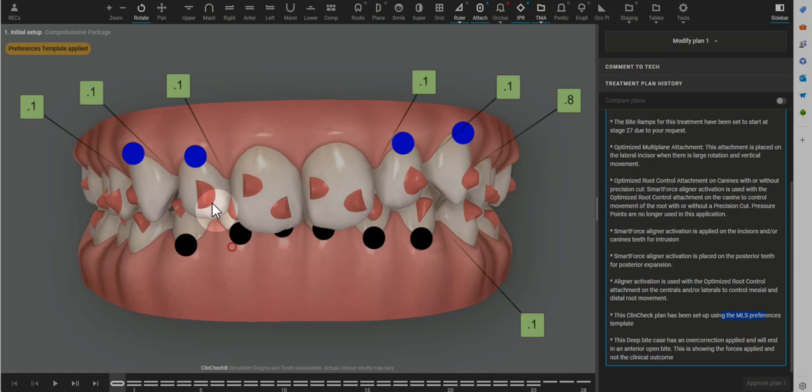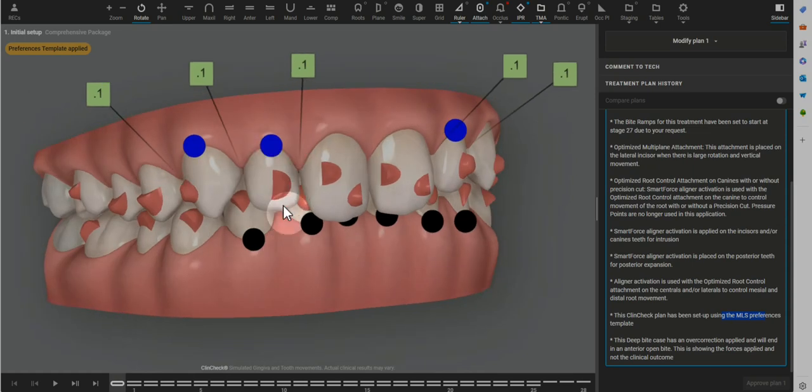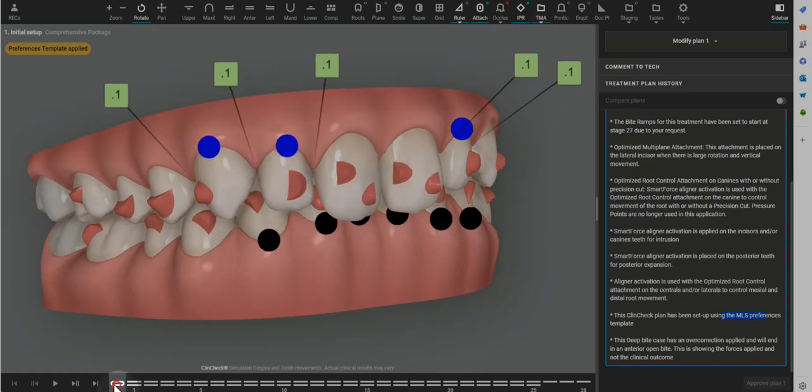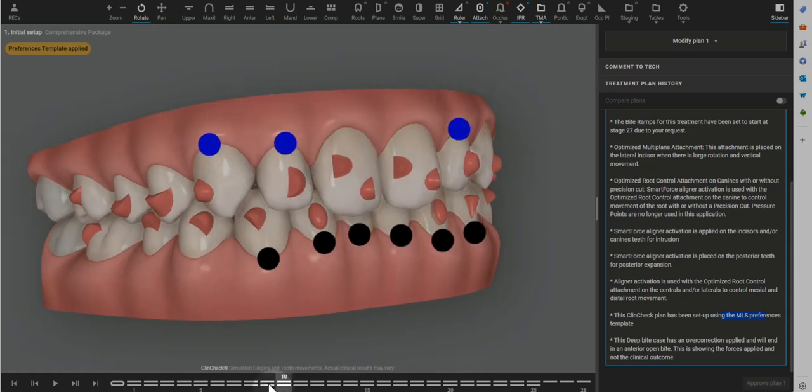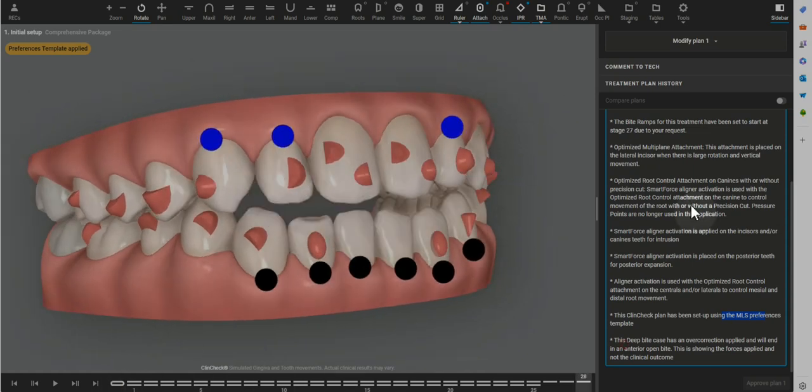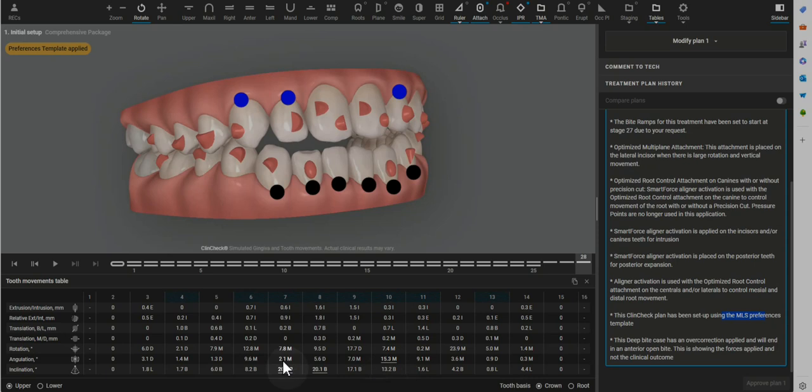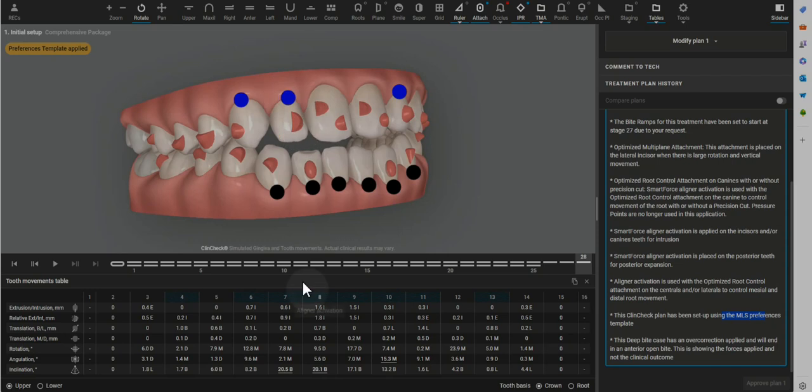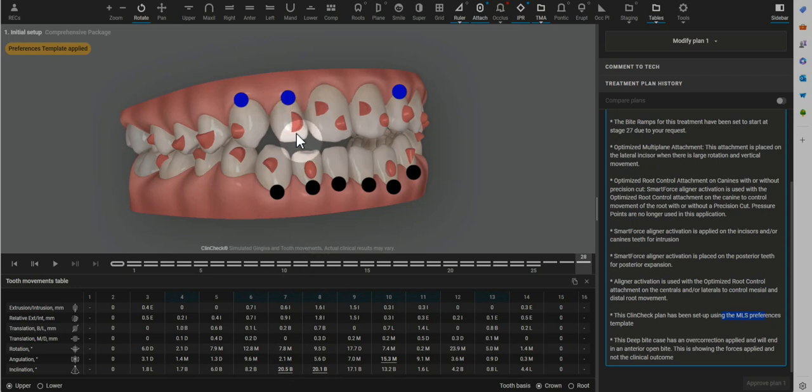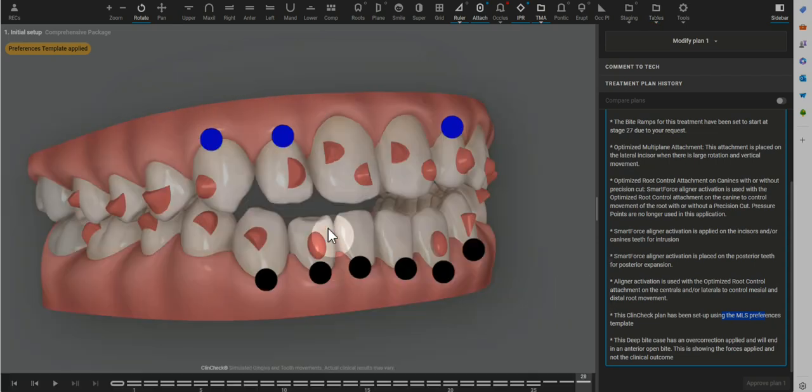Now this optimized attachment takes a little bit more investigation as to why that would have been planned. So let's take a look at the tooth movements table. So number seven is doing some angulation, not nearly as much as number ten. It's doing some buccal lingual movement and rotation. So this attachment is the number one choice of the software for lateral rotation. I don't find it as effective, and I've gotten some really good rotation of laterals with the optimized retention attachment.